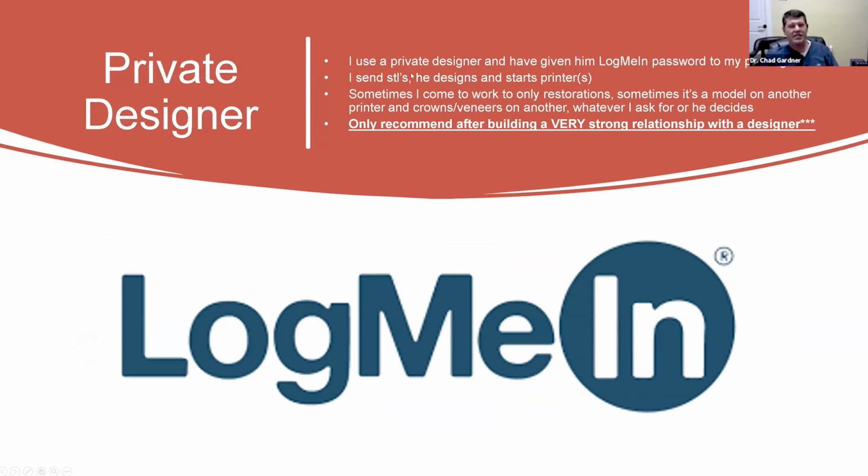I use a private designer and I installed LogMeIn on my PC and I gave him the password and everything. I've been working with him for years. I trust him. I know him. We've spoken on the phone, email many times. I send him the STLs. He designs and logs into my printing computer and starts the printers.